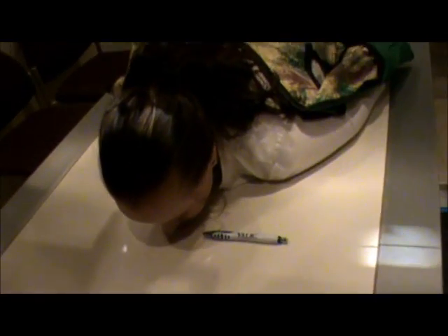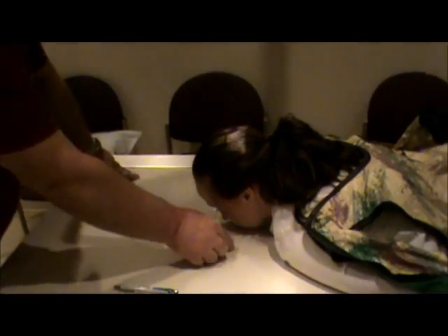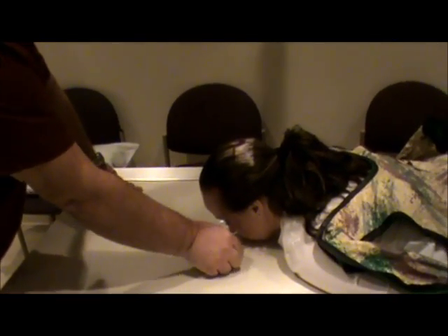There is a little bit of light here, so I'm going to move in with my pen and put my marker right there so it's in the film but not obstructing anything. This is going to show the nasal septum. That's our Waters view for nasal bones.